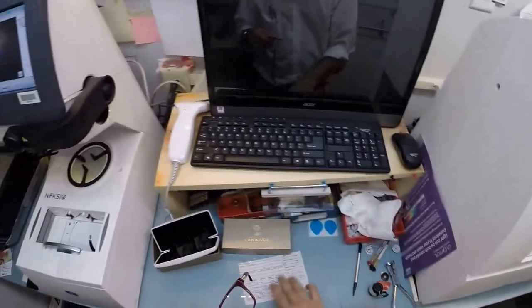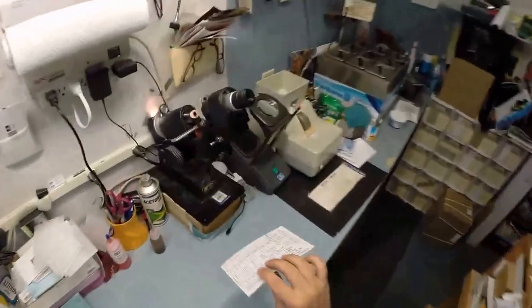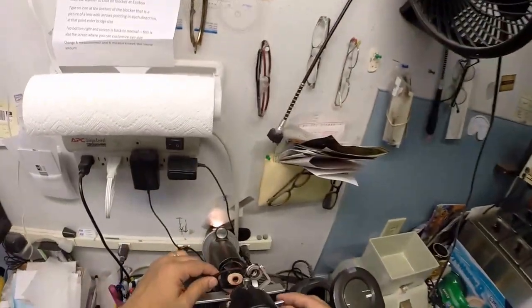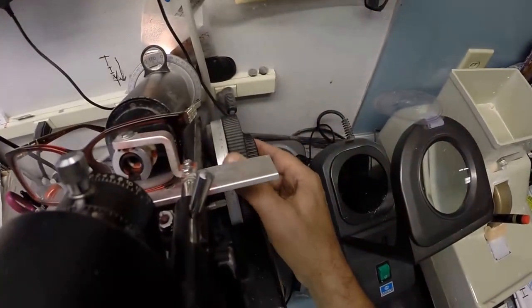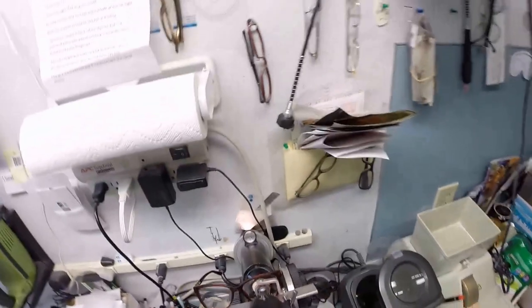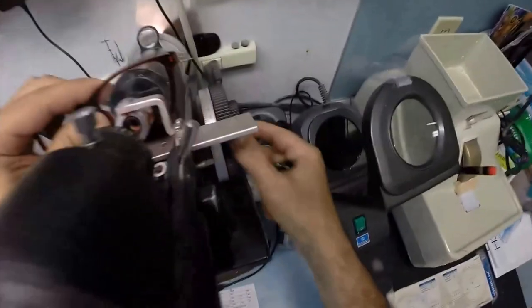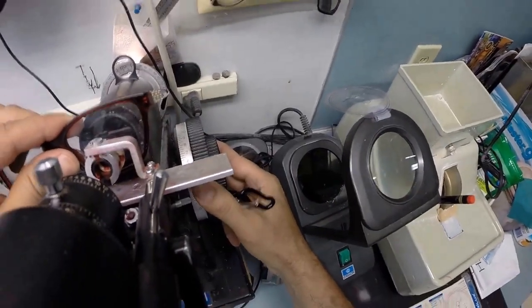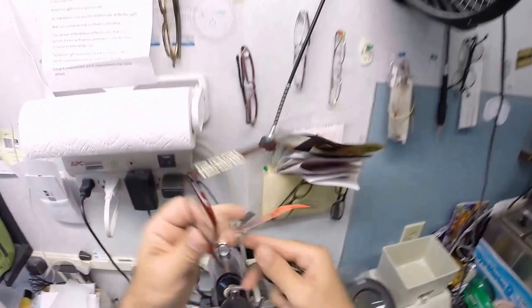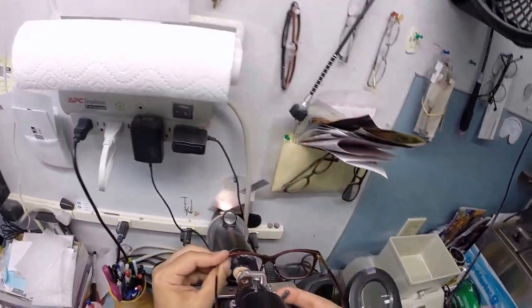Take off the double-sided adhesive sticker. Let's come down here to my Marco 101 lensometer, put it in over the top, read the power of the distance, and I'm getting zero. Non-prescription lens. We're going to read the front of the bifocal power, and I'm getting plus 1.75, one tick mark away from two. Flip it around for all the optical nerds out there who are going to write letters saying I'm not doing it right. What do you know, I'm still getting 1.75.